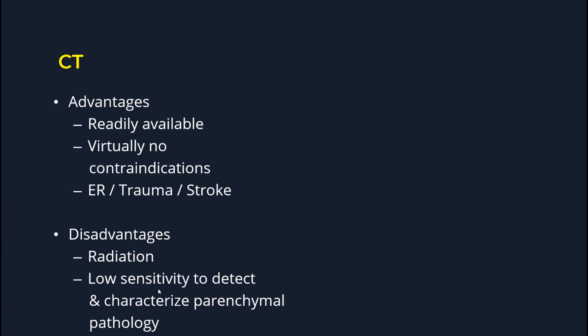Keep in mind the advantages of CT. It's a readily available modality, basically has no contraindications, and it's excellent in the emergency room setting. Some of the disadvantages include radiation and low sensitivity to detect and characterize pathology.